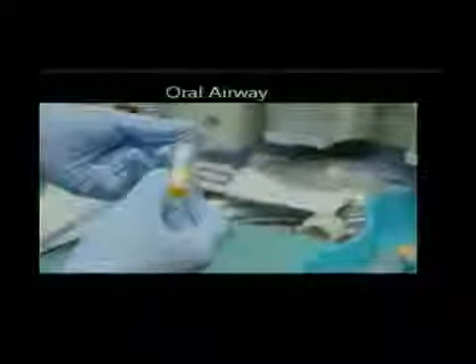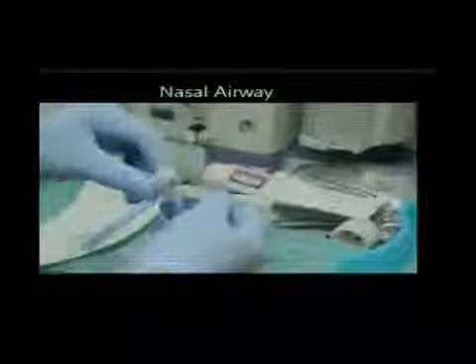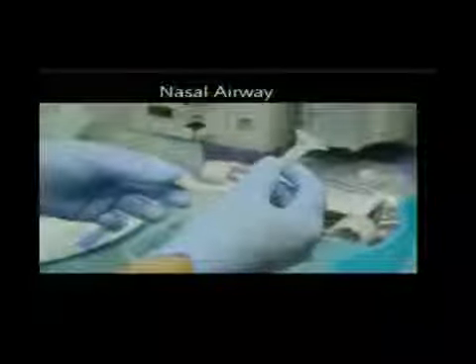There's emergency airway equipment that must be available. That's an oral airway to pick the tongue up from the back of the throat. This right here is called a nasal airway. That goes through the nostril to the back of the throat, again, so that air can go past the tongue into the trachea. This is called a laryngoscope.